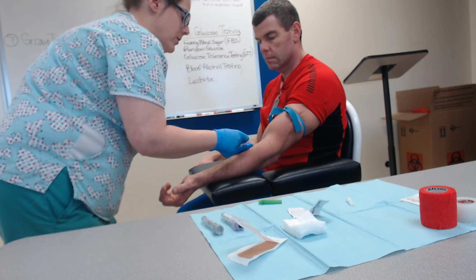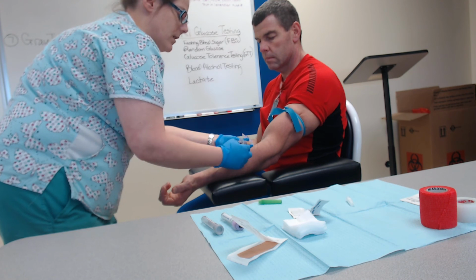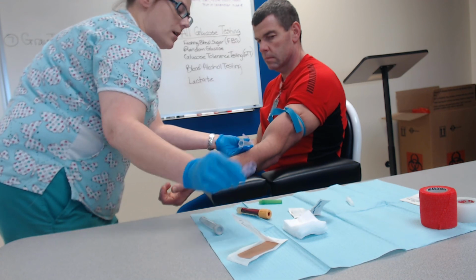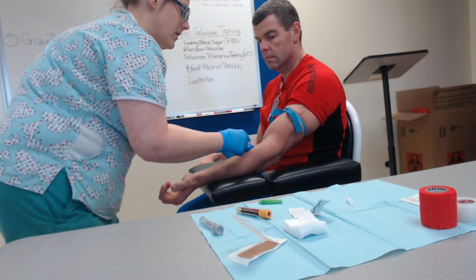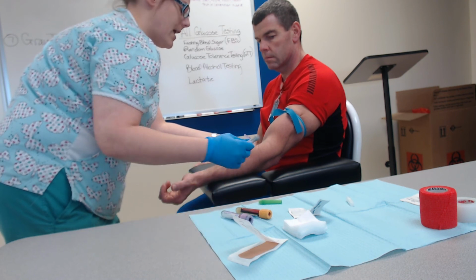Go ahead and put your first tube in. You want to use the little wings on the side of the holder to help you push the tube in. Once that tube is filled, go ahead and pick up your next tube and put that one in. Let that one fill all the way up. And then your last tube.